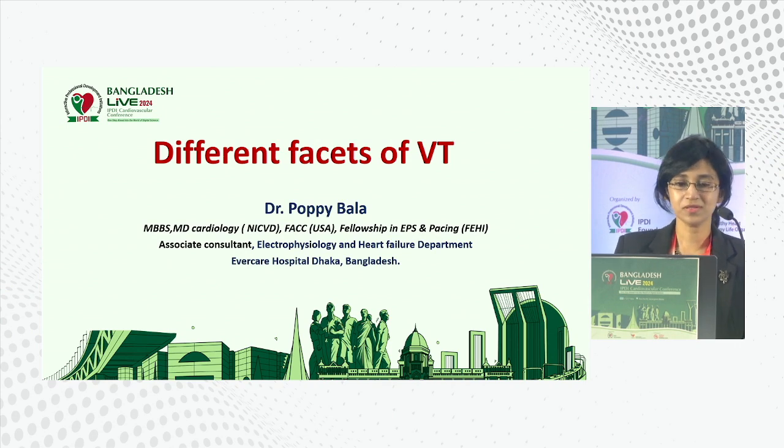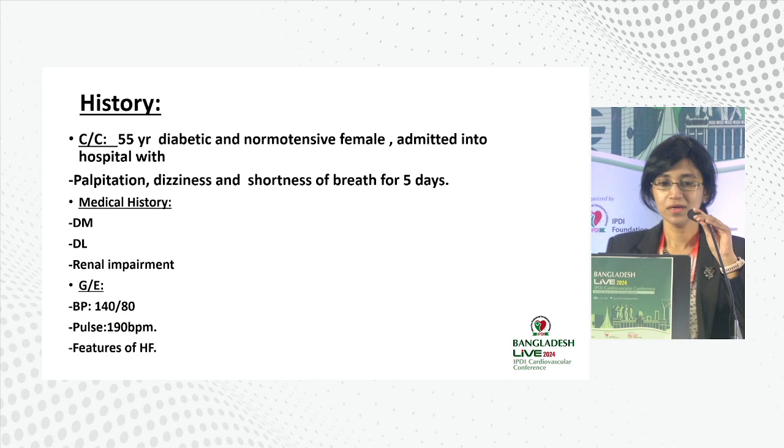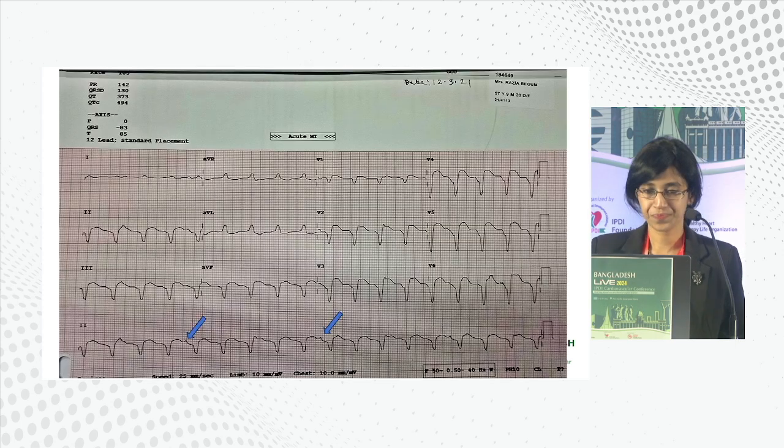Today I'm going to present on the different facets of VT. Let's start with the history. A 55-year-old diabetic and normotensive female was admitted to the hospital with palpitation, dizziness, and shortness of breath for the last 5 days. The patient was hemodynamically stable with a pulse of 190 beats per minute and features of heart failure. This was the ECG done in the emergency department.